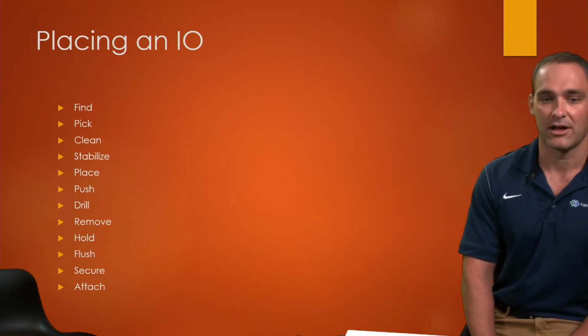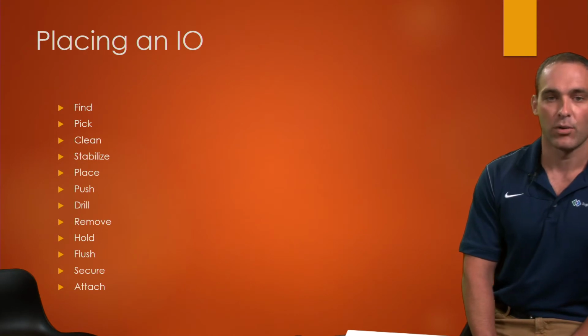Then you're going to drill until you hear either a popping sound or you get less resistance. Be very careful to not drill too far through, where you're either stuck in the backside of the bone or have gone completely through the backside of the bone. Then you're going to remove the drill, the whole time holding that bottom hub. And then you're going to hold the bottom hub and remove the top part of the needle, which is the actual metal needle part.